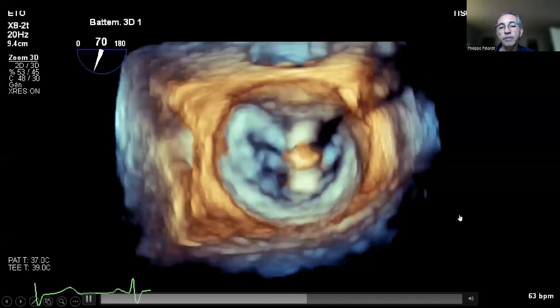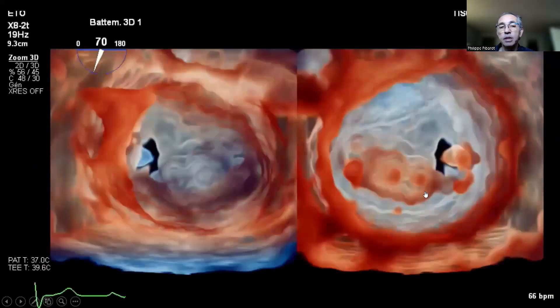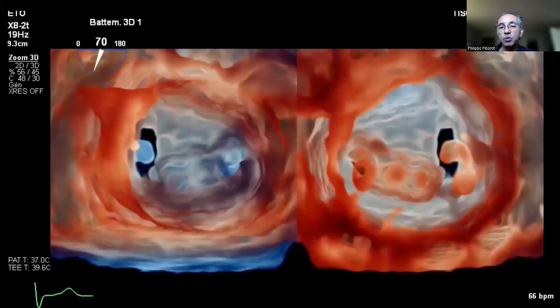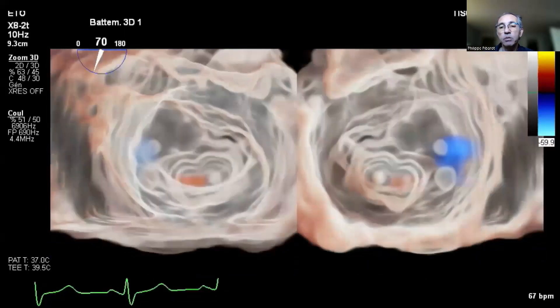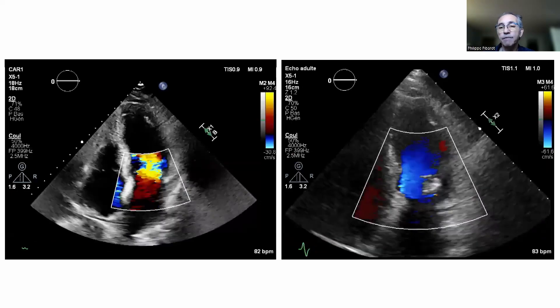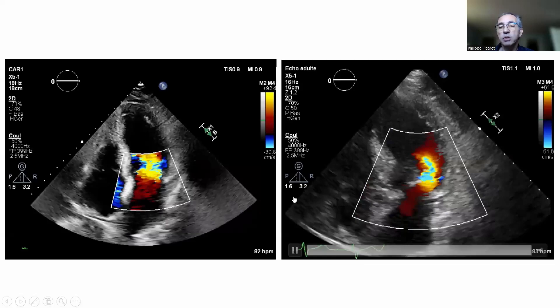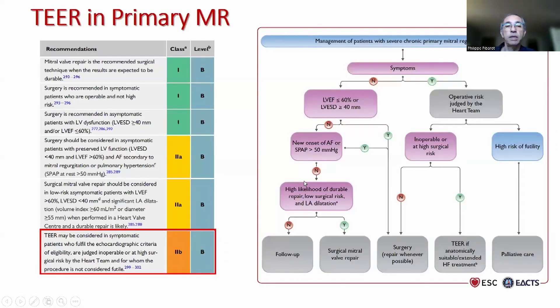After placing the first clip, there was some residual MR, so a second clip was placed. With two clips in place, the final result showed only a trace of residual MR.